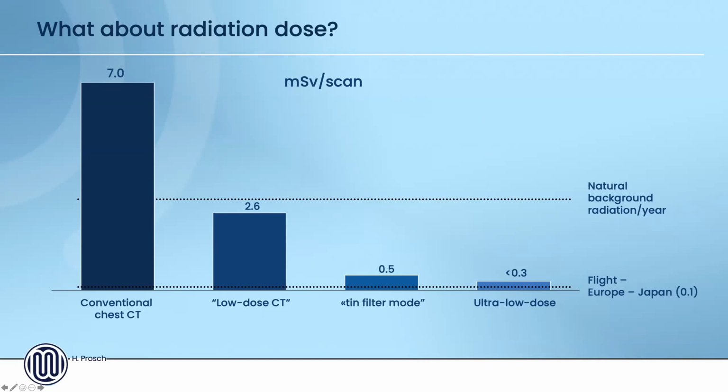But nowadays, with our modern CT scanners, CT scans can be performed with a much lower radiation dose. So this is what we call a low dose CT scan, with a radiation dose of certainly less than 3 millisieverts, and with even more modern scans, which we perform just to screen for abnormalities, we can be in the range of 3 or 5 chest radiographs, so very, very low radiation dose. And it's not to be expected that you see any damage to DNA with these very low radiation doses. So don't be too afraid or concerned about radiation dose. The information gained by CT is much more important than the risk associated with CT. But again, you should avoid repeated CT scans, as this adds up the applied radiation dose over time. Okay, if there are any questions, just post them in the Q&A box, and if not, I will move on.